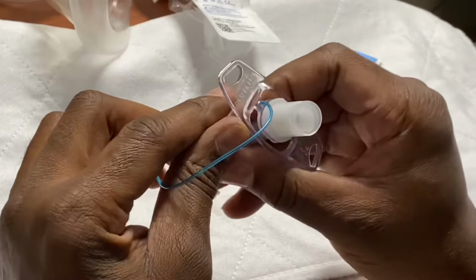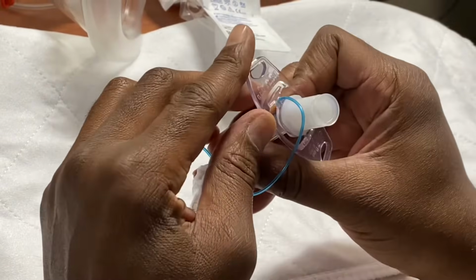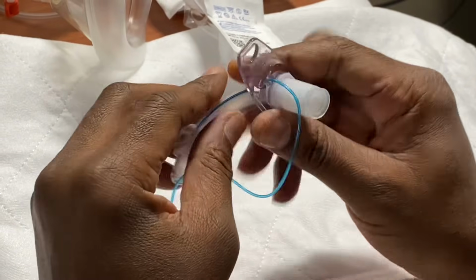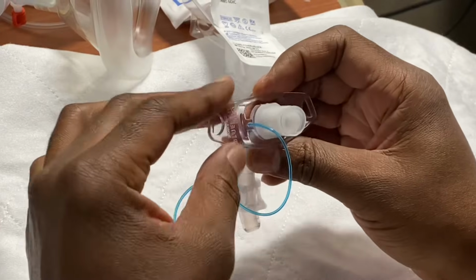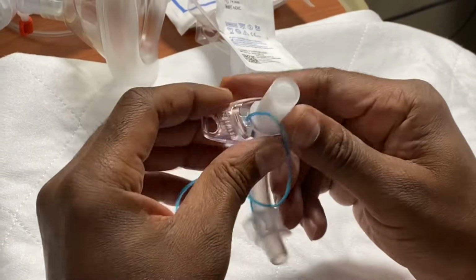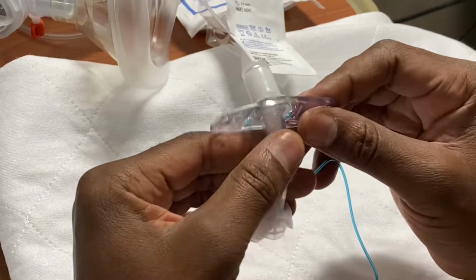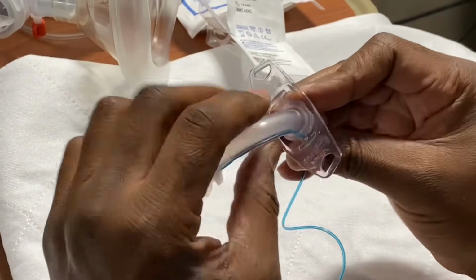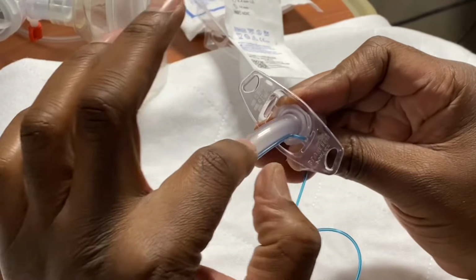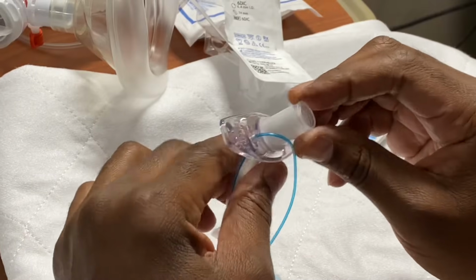Okay, so we have here two trachs, and this class is on Tracoe, our newest trach. But I just want to discuss with you the differences between our old trachs and the newest trach that we're coming on board with. So this is a Portex, and as you can see, it's non-fenestrated. Typically, the word fenestration just means hole. Just keep it simple. It means holes. So this would have holes in it if it had fenestration, but because it doesn't, it's just smooth. I'll show you a fenestrated trach in a second.